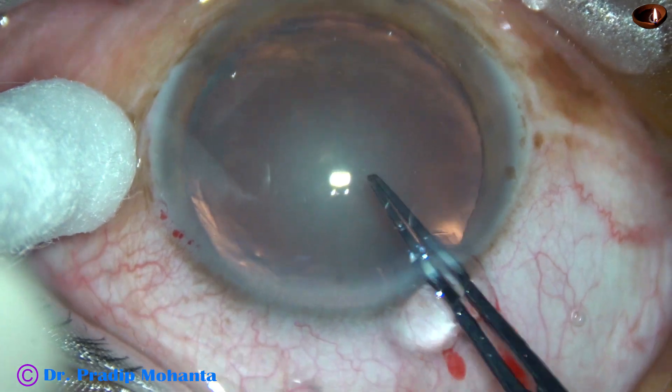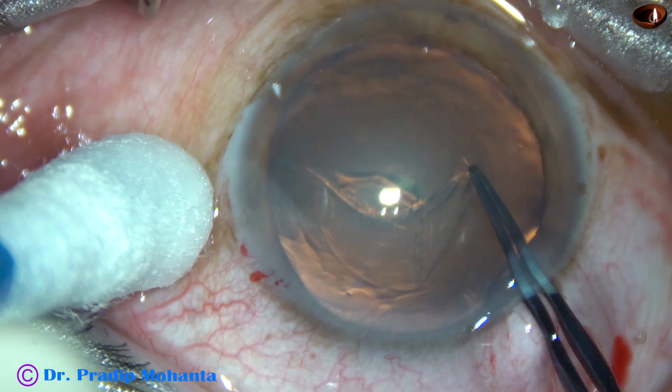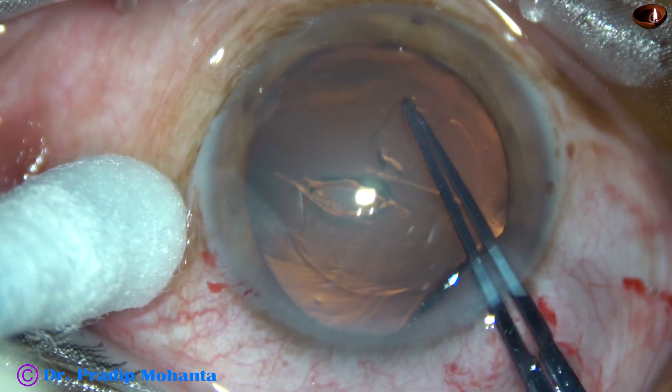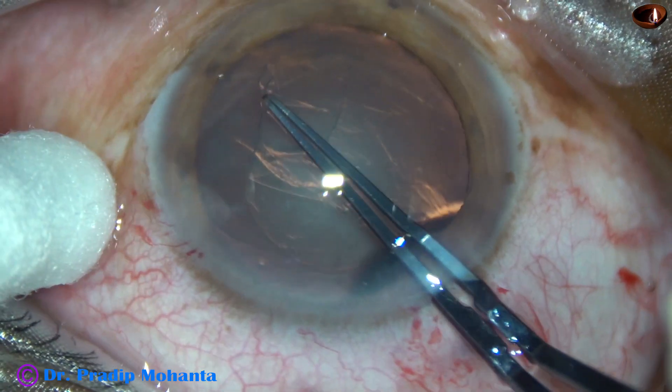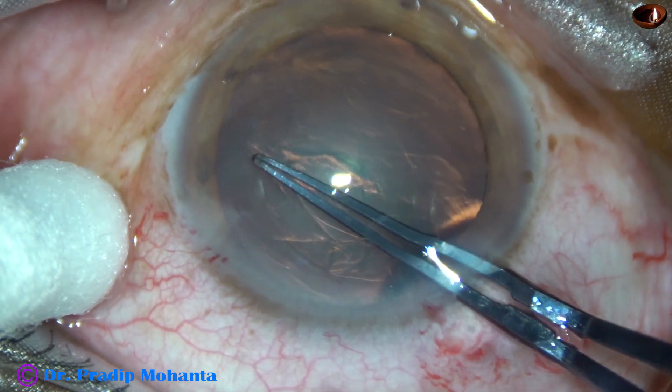Now, capsulorhexis. A capsular tag is raised by the tip of the utrata forceps itself. The tag is rotated anticlockwise, and a rhexis of about 6 mm is obtained.